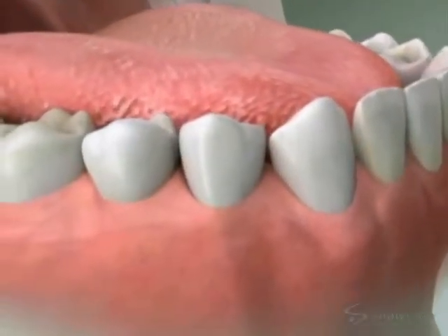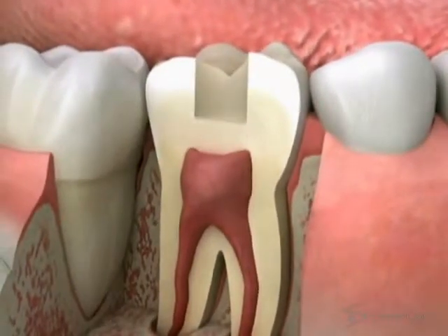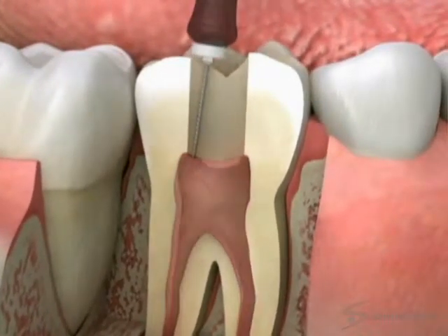To get at the infection, we make an opening through the top of the tooth down into the pulp chamber. We use a dental file to carefully clean out the infected tissue and shape the canals to receive the filling material.